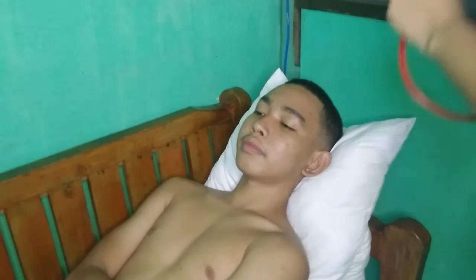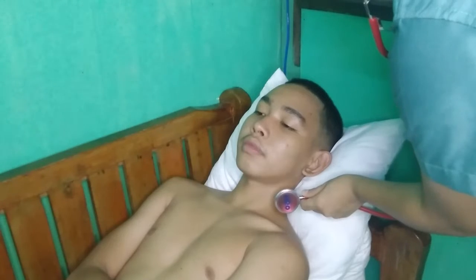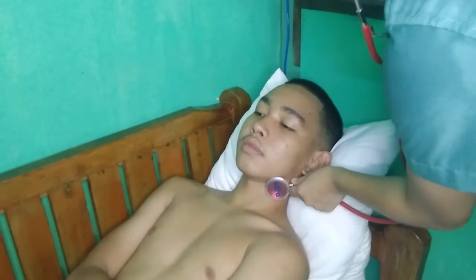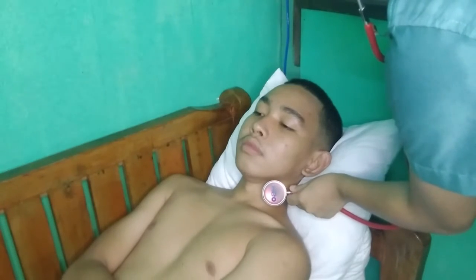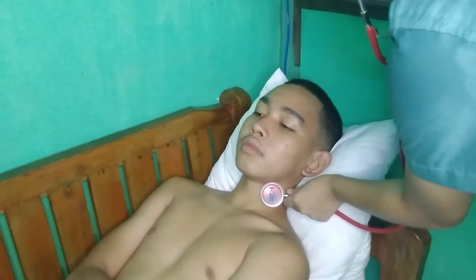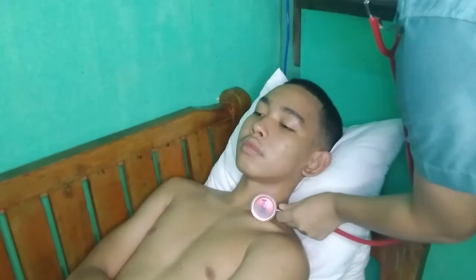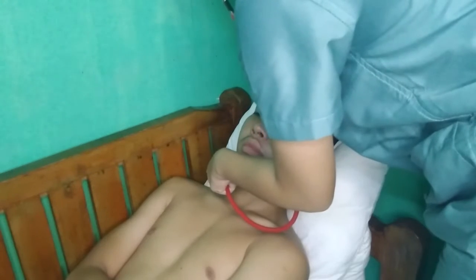Okay, so let's listen first at the angle of the jaw. John, can you please take a deep breath and exhale? Then in the mid-cervical area. Take a deep breath, then exhale. Okay, again. Okay, that sounded great. And then you're just going to compare sides and repeat on the other side.